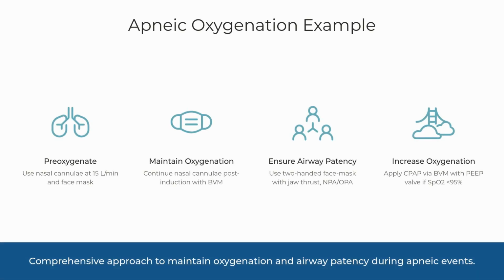Here is a step-by-step example of apneic oxygenation in action. First, remember apneic oxygenation isn't a replacement for preoxygenation. It's an adjunct that extends safe apnea time. It's most effective when paired with a solid preoxygenation strategy to maximize oxygen reserves.